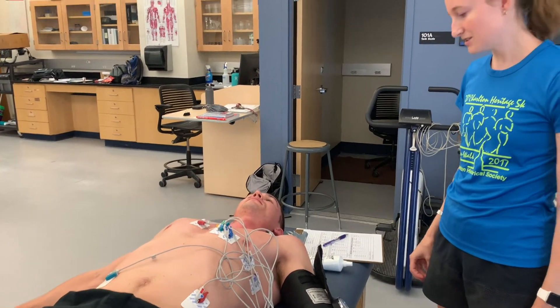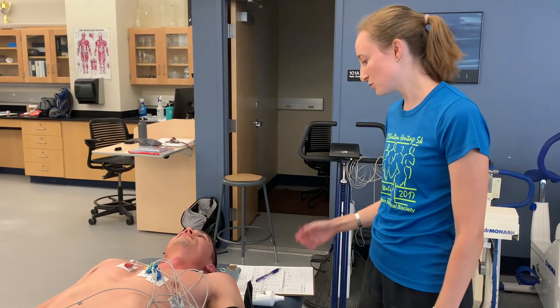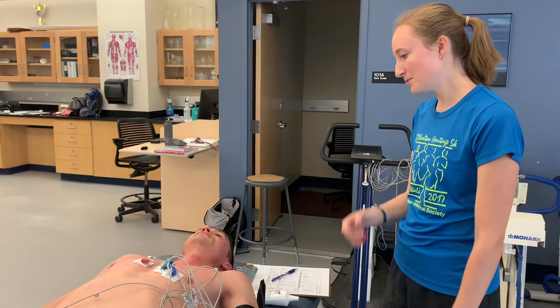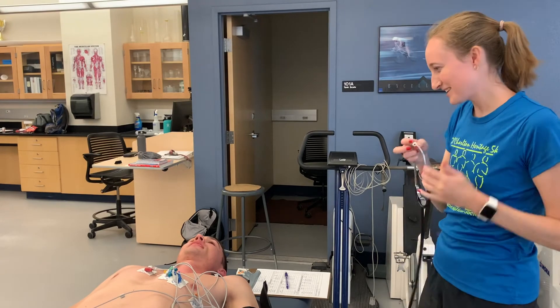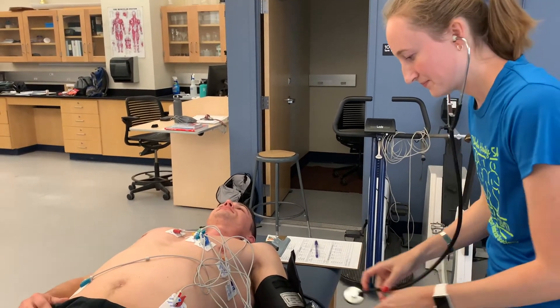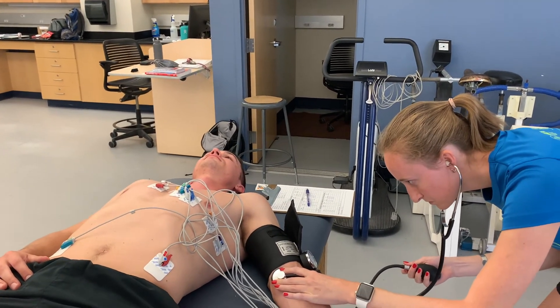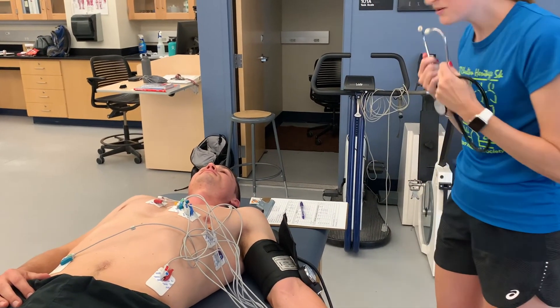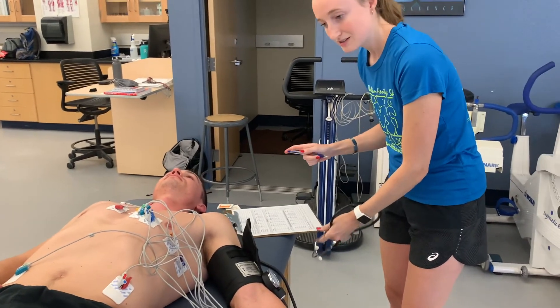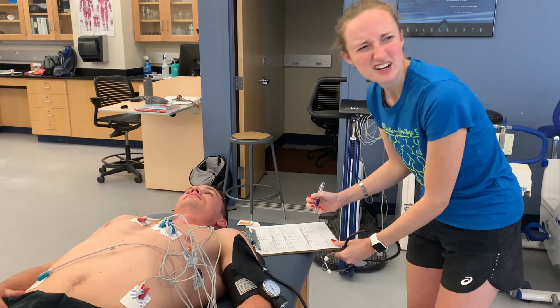The goal in recovery is to get their heart rate back below 100, and you want their blood pressure to be looking back more towards normal. We're just going to do a couple more readings to get his blood pressure back down, but his heart rate is already 83, so that's looking great. We're going to go ahead and take that five-minute blood pressure — 140 over 80, which is really close to his resting. So we are good to go. Heart rate is 83.